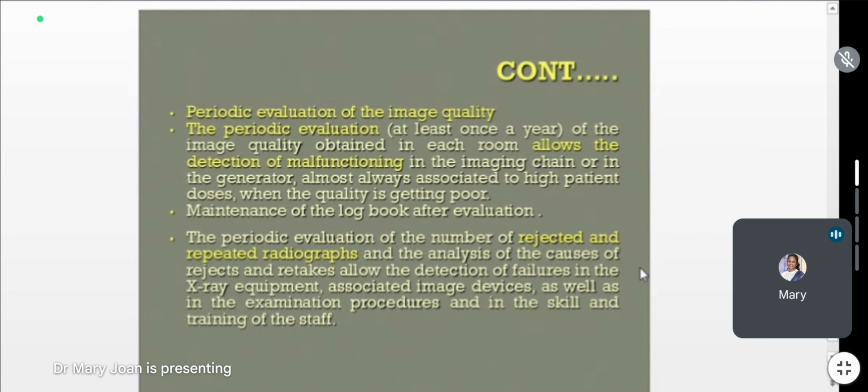There could be machine problems, there could be system problems, there could be other problems like electrical problems, engineering problems, humidity, temperature, all those problems. There could be practice problems like how the people are conducting the practice while they are acquiring the image, who is accompanying the patient, who is coming inside, all those things also, and what all results in repeat of the procedures. Evaluation of that will enable us to take precautionary measures to avoid them further happening in the practice.